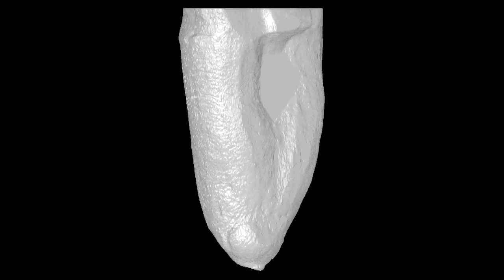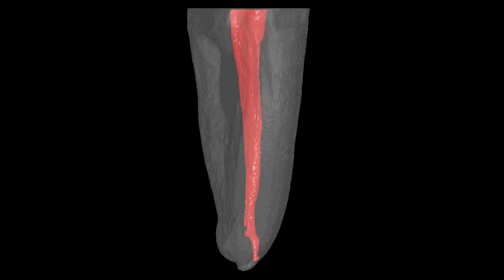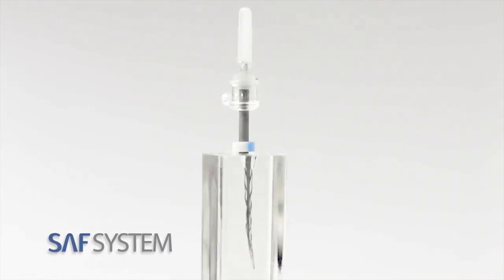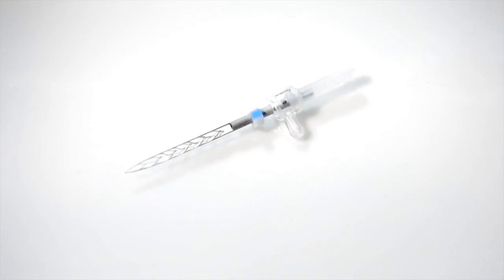3D cleaning, shaping and obturation of root canals have always been the desired goal of endodontic treatment. However, most root canals are not round in cross-section, making 3D endodontic preparation with rotary files a difficult and challenging procedure. The self-adjusting file system, based on a hollow file that adapts itself to the irregular shape of the root canal, overcomes many of the current drawbacks of rotary file systems.